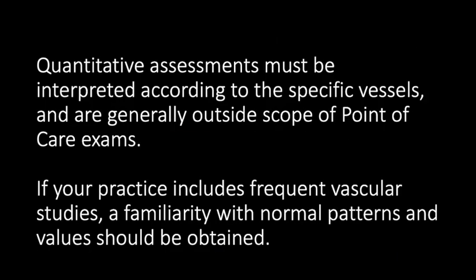My final reminder is that all of this data, from qualitative to quantitative, must be related to the specific vessel that one is imaging. This level of precision and expertise in interpretation doesn't really lend itself to the screening nature of POCUS exams. But there may be certain practice environments, such as if you work in a wound care clinic or if you plan to do more advanced echoes in your office in the future, that might persuade you to learn these skills and practice them. Regardless, I hope you found this an interesting exploration of a relatively uncommon use of point-of-care ultrasound.